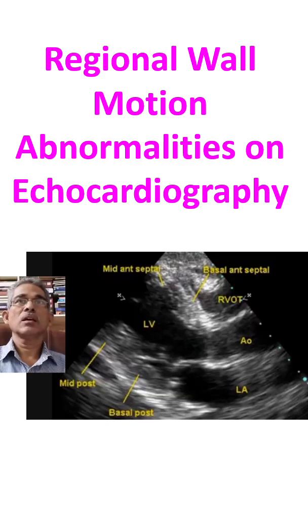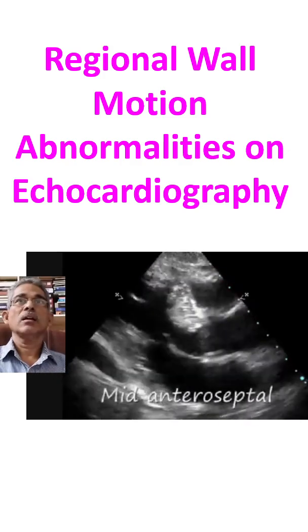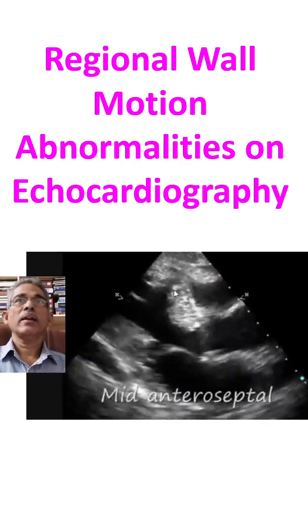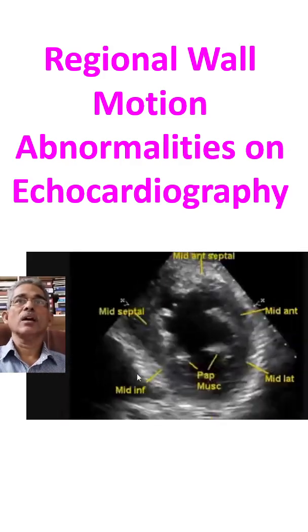We will move the image, and you can see mid-anteroseptal hypokinesia.